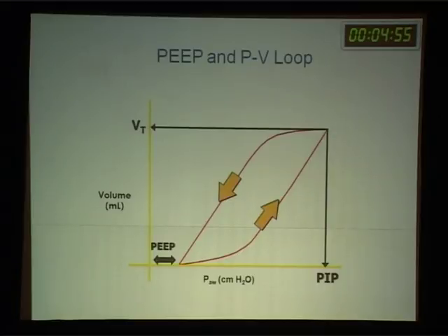Okay, now, what is it here? That is PEEP. If you apply PEEP, the whole scalar moves to your right. That's what you need to know.